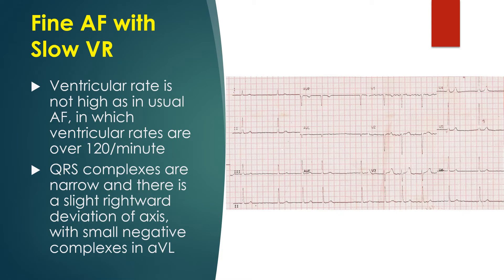In this case with fine atrial fibrillary waves, the ventricular rate is not high as in usual atrial fibrillation, in which ventricular rates are over 120 per minute. The QRS complexes are narrow and there is slight rightward deviation of axis with small negative complexes in AVL.